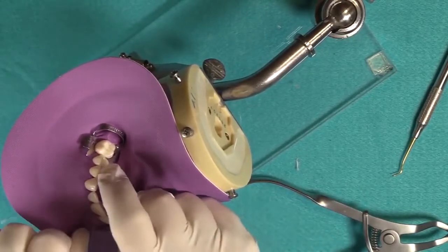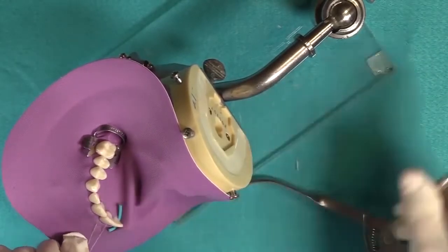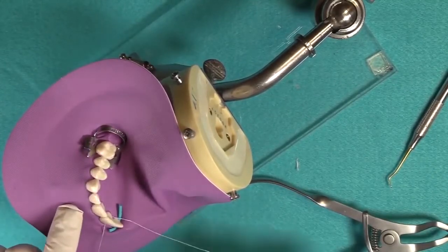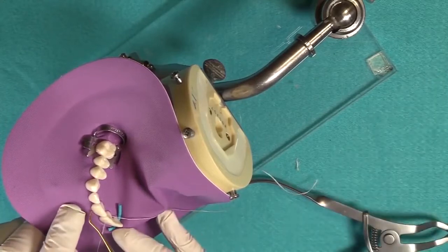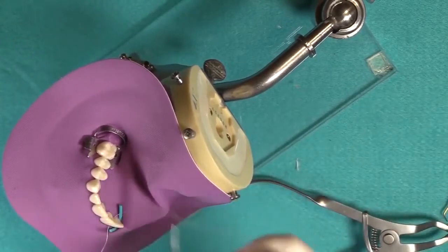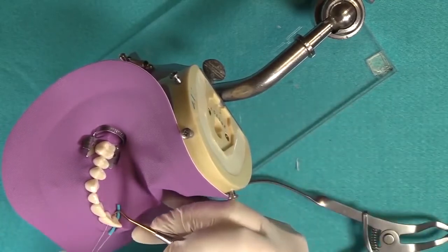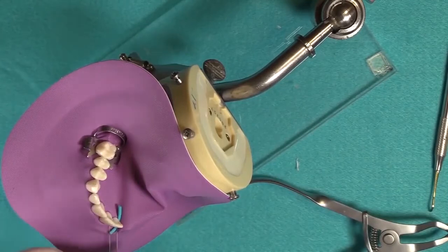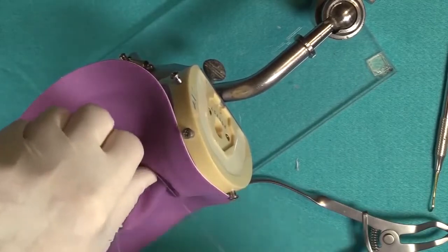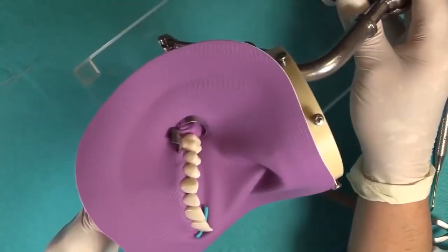Depending on the clinical crown, some clinical crowns aren't erupted very well. This technique will give you access. And sometimes, if your class 5 is not subgingival, let's just say it's just right in here, you don't necessarily need a retractor clamp. So it just depends on how deep that caries lesion is. Look at how well that is sitting in there. That's just perfect. And so, there we go. And then just simply invert. See, the inversion is important because it seals the dam around the necks of the teeth. Just like that. And see, it's perfectly inverted.